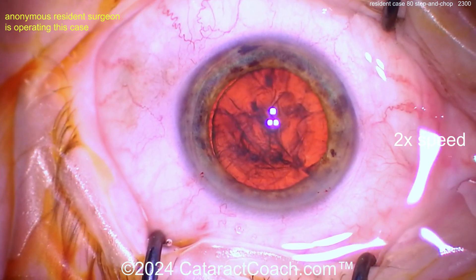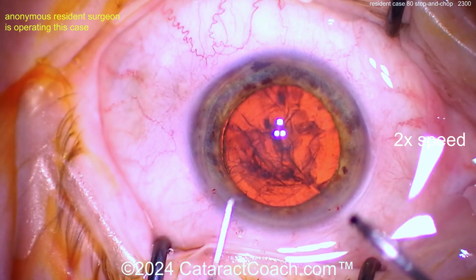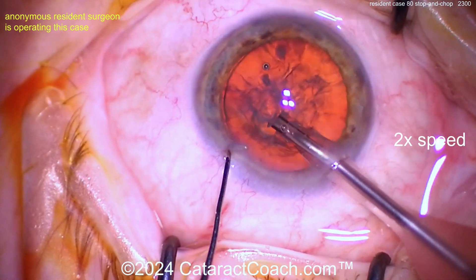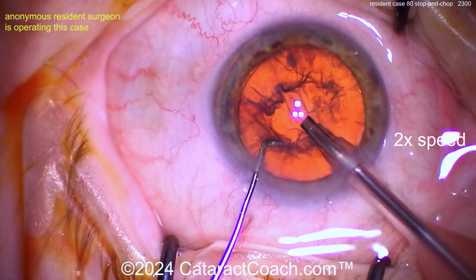Now let's see the technique. Here comes the phaco probe in the right hand, looks like a chopper in the left hand — looks like the Nagahara chopper maybe. This is stop and chop, as we saw from the title. Let's see the groove down the middle.